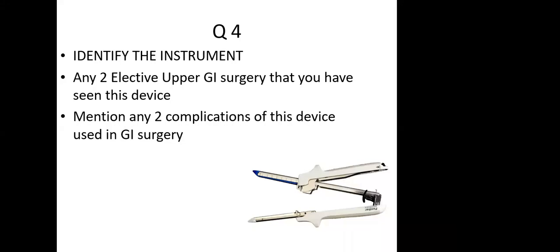The bowel that we are going to staple and cut should be within the range of the firing of the staplers. That means I would like to see that there is no additional tissue beyond the structure that is to be fired. If you are creating a Roux-en-Y loop, you should not have a piece of omentum between the stapler blades. If you are transecting the duodenum, you should not have the bile duct in your staple line.